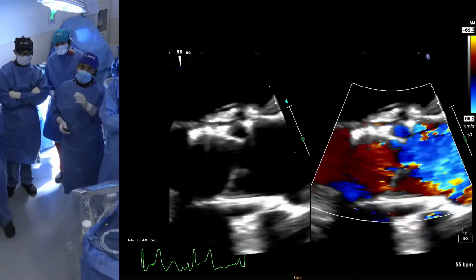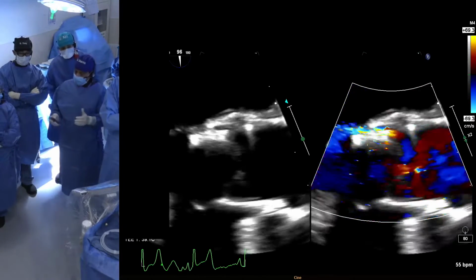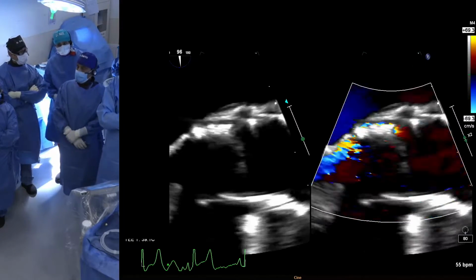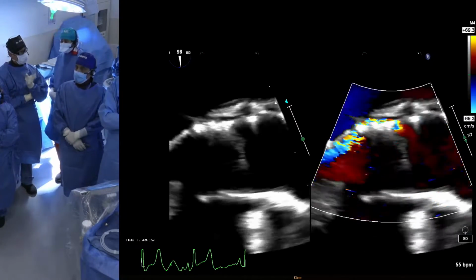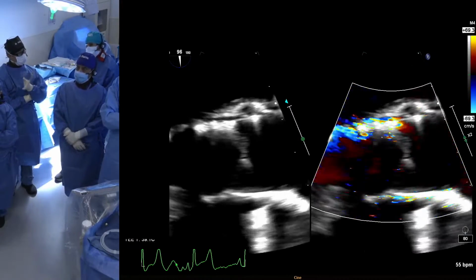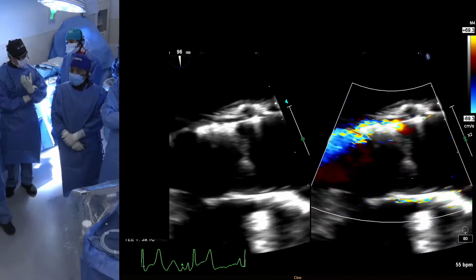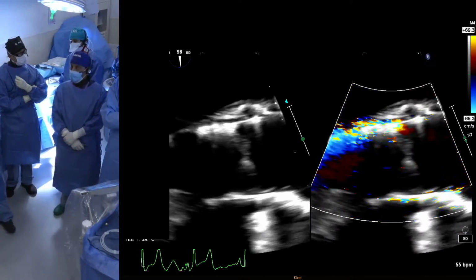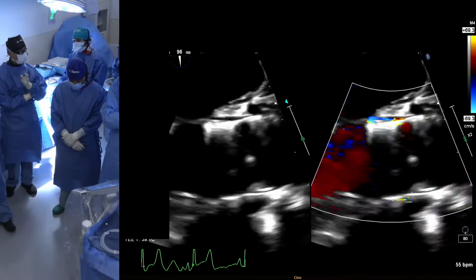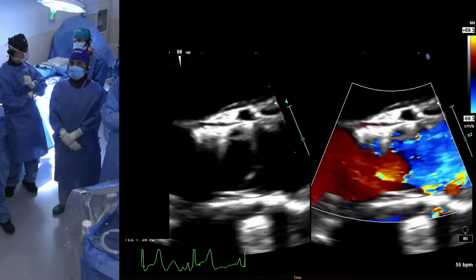That's a good point. So that's part of the discussion. Would this patient have benefited from a self-expanding valve because of the skirt shape design? Well, the challenge with such a big LVOT and a low left main is that it's going to be harder to protect the left main with a self-expanding valve. Also there's a risk of diving, and because self-expanding valves rely on passive expansion, you might actually have more PVL. So in our mind, a balloon-expandable valve with this kind of anatomy gives us the more predictable result. I think definitely in average hands in terms of predictability.